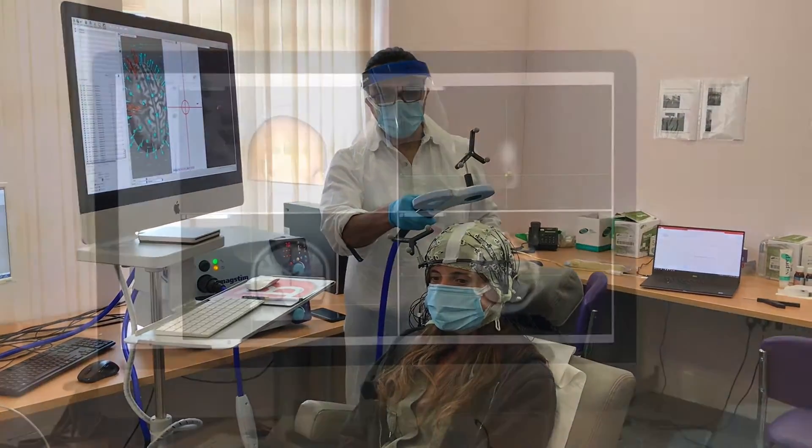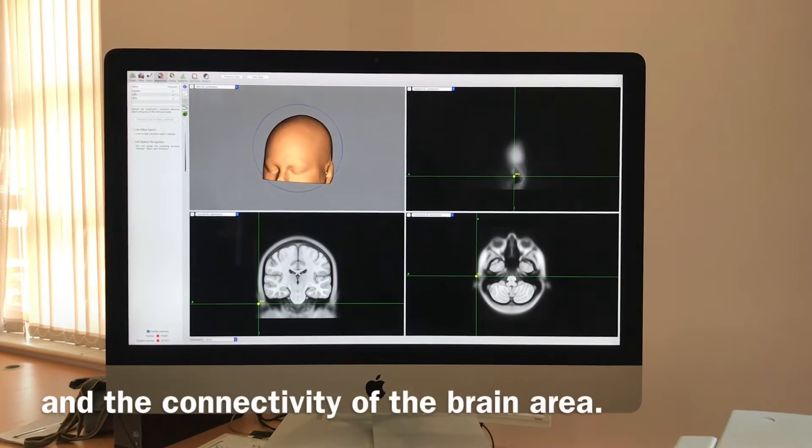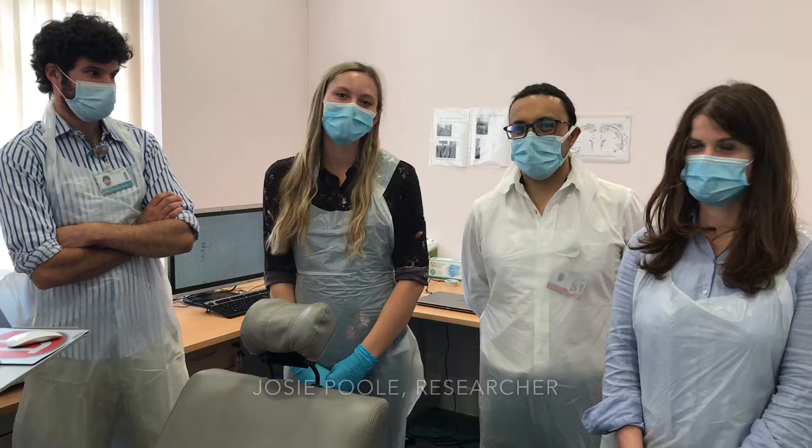And we are able to explore more in detail the excitability and the connectivity of the brain area.